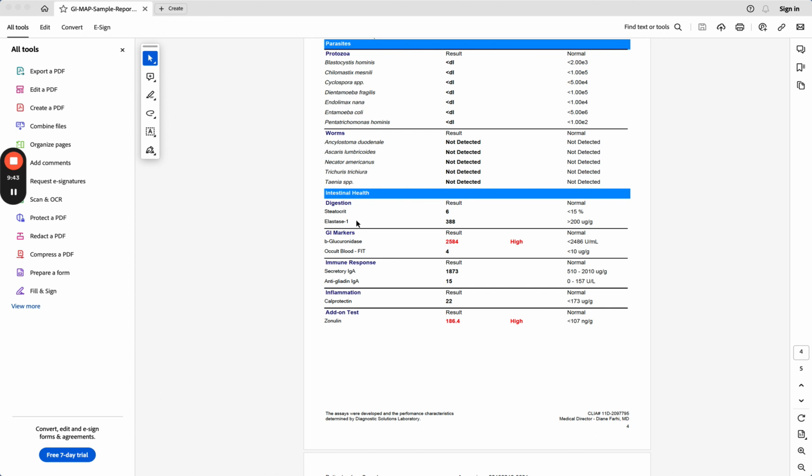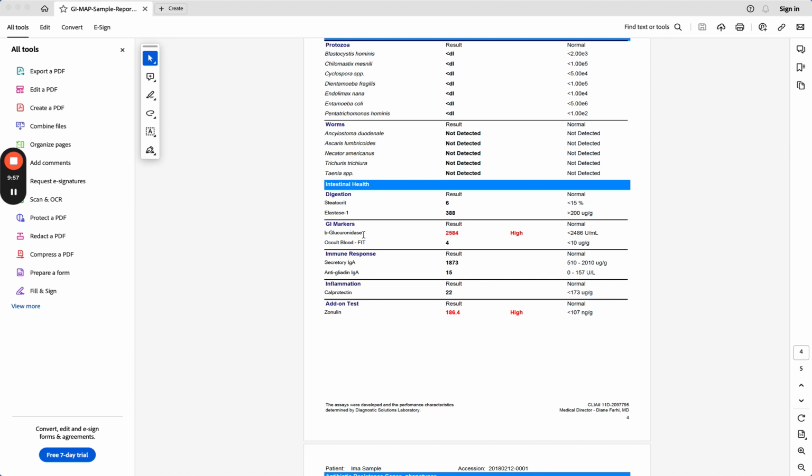Now, if you haven't been eating, if you have been sick or something like that, some of these markers will be changed. And always, we have to consider the clinical situation that is happening with you when we interpret this test.